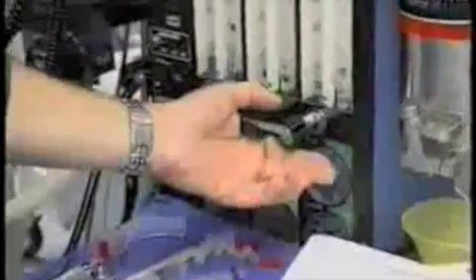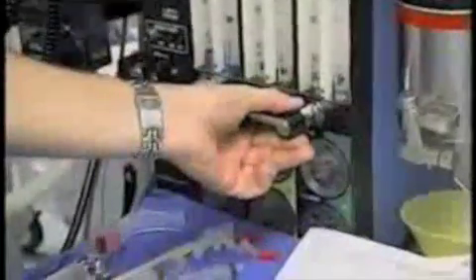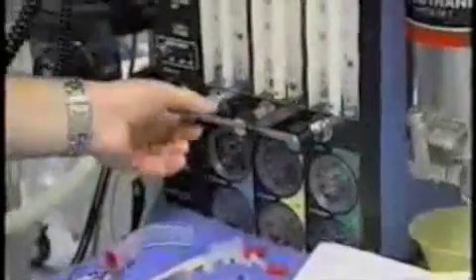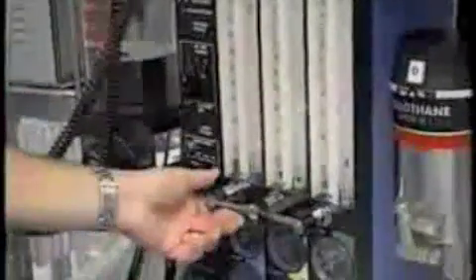In addition, one cannot turn the oxygen completely off. There's always some residual oxygen to deliver to the patient. On some machines, you cannot deliver too much nitrous oxide without the oxygen rising to match it. And one can see here that an alarm is going off from the excessive nitrous oxide.